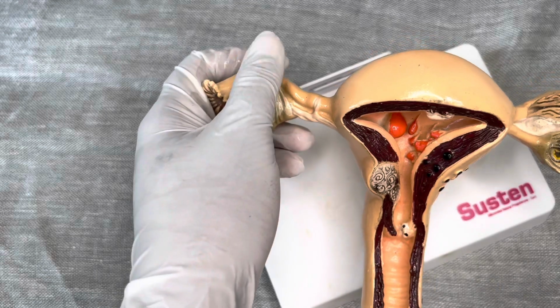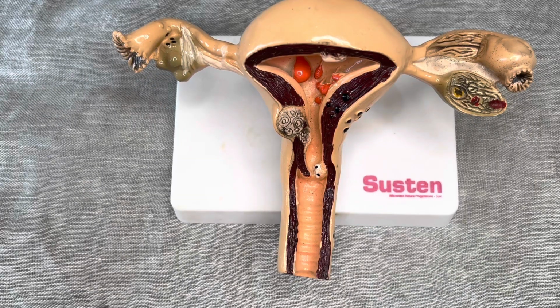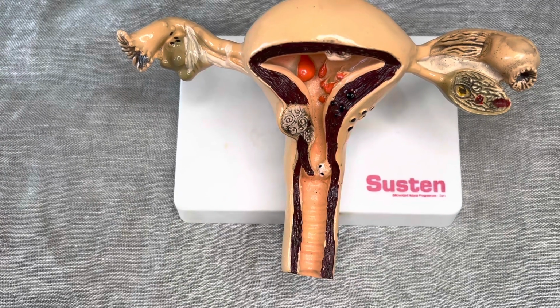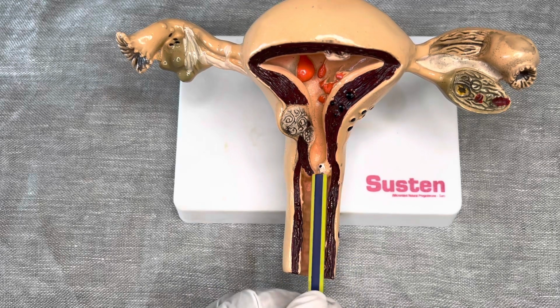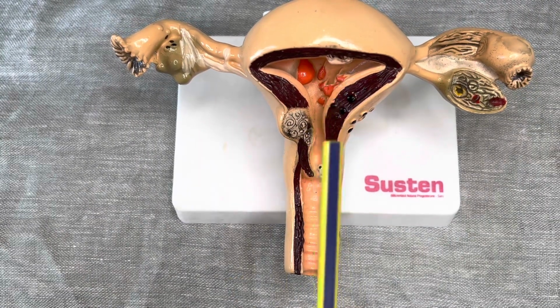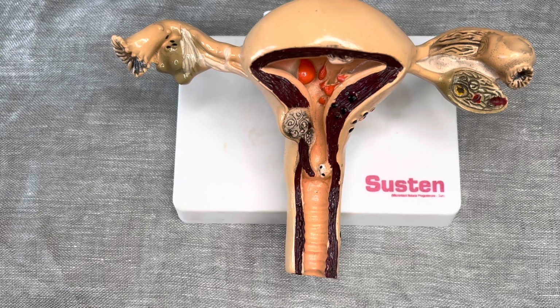There's another instrument called a tenaculum, which will help you to hold the cervix up when you want to insert a thing called a uterine sound. What that thing does, basically, is it's like a metal thing. For today I'll be using a pen, I'm sorry for that, but the sound is like a metal thing which you go in with so that you feel the fundus, so that you know how many centimeters it is. I'll explain why it is important for you to know how many centimeters up it is, because different people have different measurements, yeah? But we have the round figure that we have for everyone.